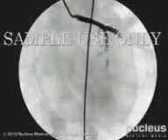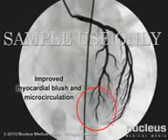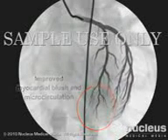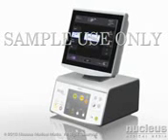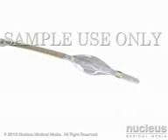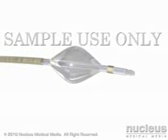An examination of the blood flow from the left anterior descending coronary artery now reveals both an improvement in the myocardial blush, with more blood reaching the ischemic zone, and a reduced infarct size. The Pixo Impulse technology from Miocardico Medical Systems offers new hope for post-acute heart attack sufferers and holds the promise of improved outcomes for heart failure patients.